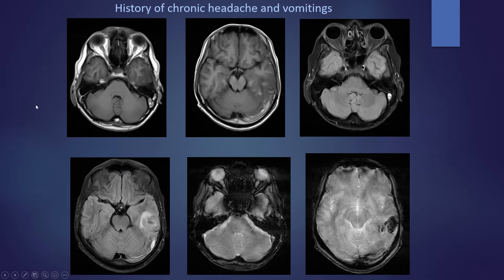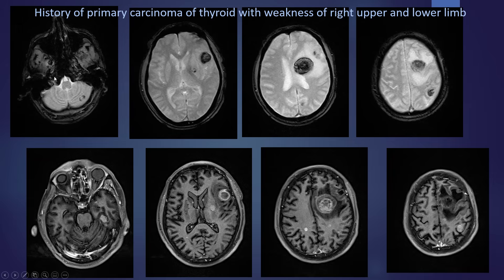A common case of chronic headache and vomiting shows a hyperintense area in the left temporal lobe with blooming on GRE and hyperintense signal in the left transverse and sigmoid sinus — a case of venous infarct due to cerebral venous sinus thrombosis. Another case of primary carcinoma of thyroid with right-sided weakness shows blooming areas in the left cerebellum, left frontal, and left frontoparietal lobes with significant perilesional edema, showing nodular, ring, and target pattern enhancement — consistent with hemorrhagic metastasis.